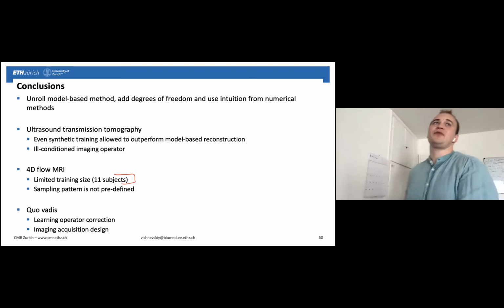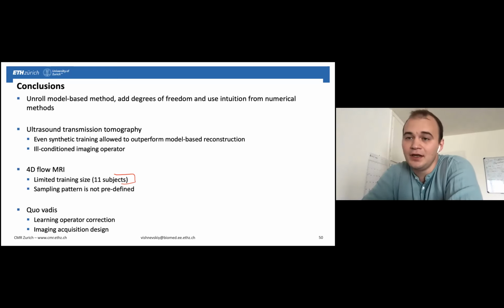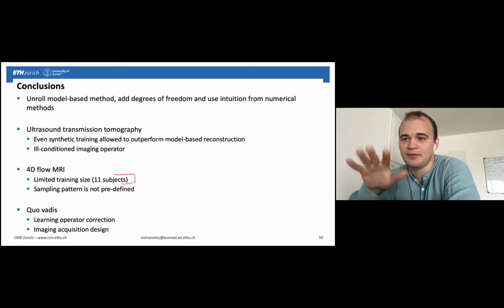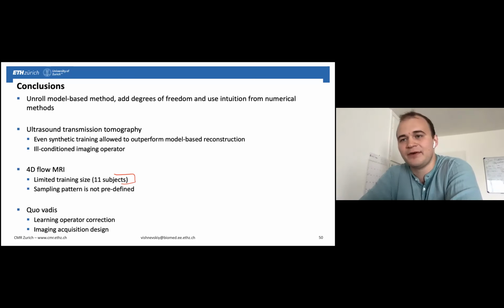Well, I cannot give you an exact number because you can make your imaging even more adaptive. For example, if you have 25 cardiac phases, in some scenarios the heart motion can be very regular, and you can average a lot in time for some parts of the cardiac cycle. For some, the heartbeat can be very irregular.